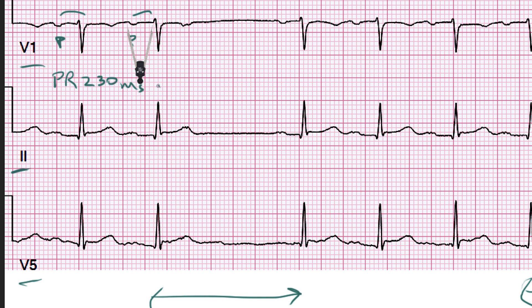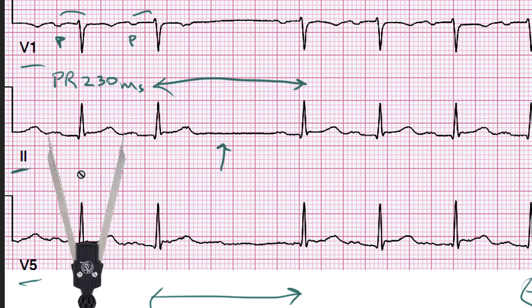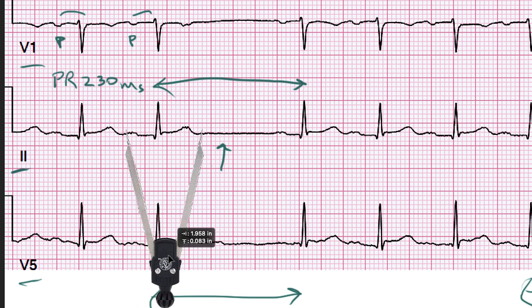But then what happens is we've got this pause. Most people will look for second degree AV block. If we set these calipers for the P-to-P interval and move them over, we would have expected a P wave to land right here if second degree AV block were present. But there's no P wave here, so you can't really call second degree AV block.